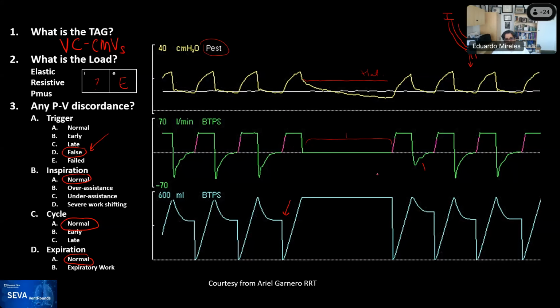A big item that is important for you in this type of ventilation is when you have these large leaks and you're using volume control, you will be less efficient at ventilating these patients than you would be if you were on pressure control. So in general, we're more attuned to ventilate patients with large leaks with pressure control modes than with volume control modes, because a large amount of the volume is going to be lost through the leak. And when you do pressure control, there's endless flow, so you can inflate areas of the lung in spite of the large leak.